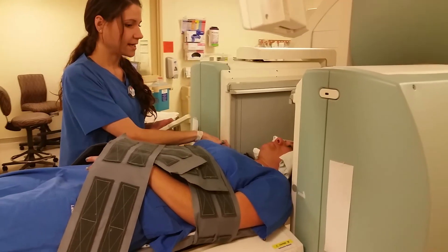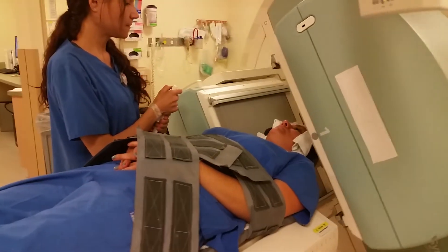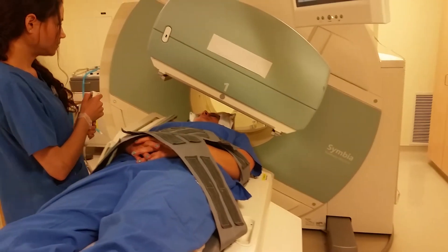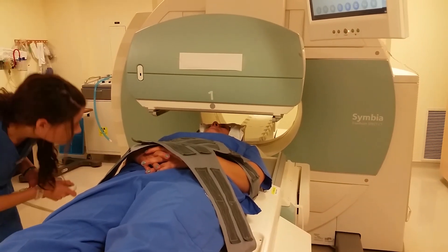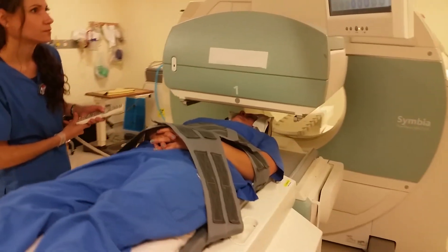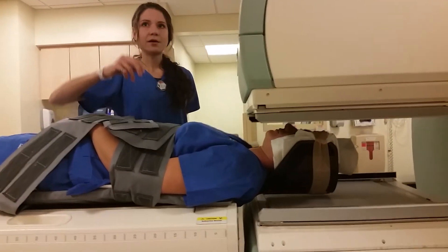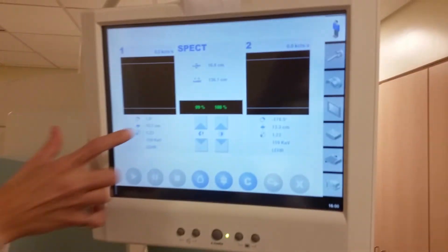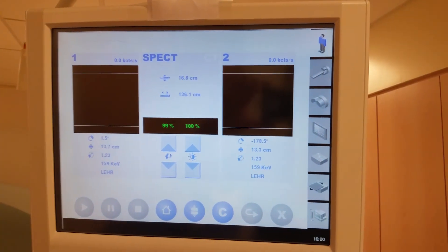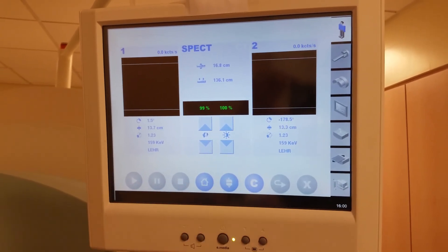I can also spin these detectors around. We call this a P-scope, and it does have the information on how far away the detectors are. We have 13.7 centimeters for detector 1, which is this camera right here. And then on the bottom, that is detector 2 — where the camera is right now, it's 13.3 centimeters.